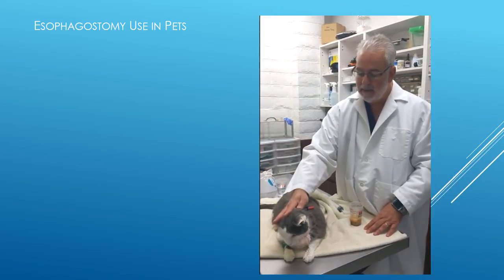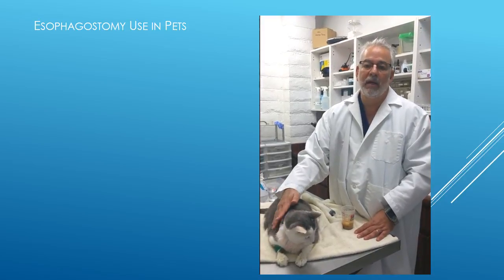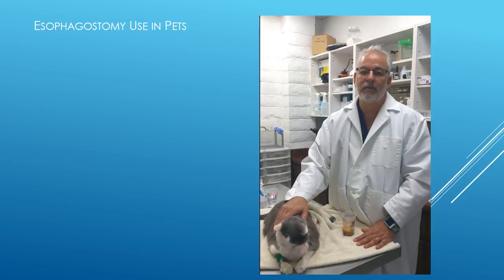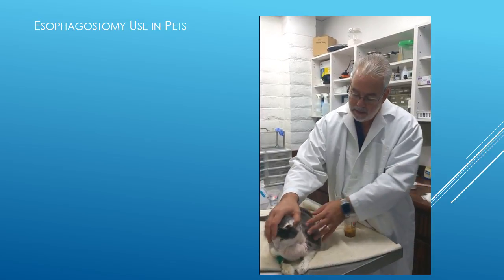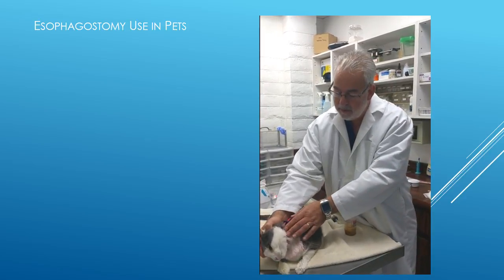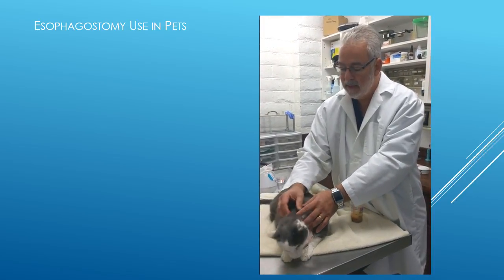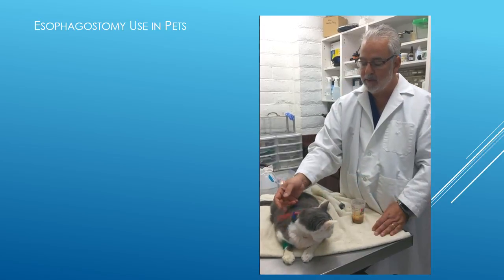This is Clyde. He's in the hospital today for liver problems, and part of his treatment is to get enough calories in him to help the liver heal itself. You can see on the side of his neck here where the tube introduces itself into the body, and then it's sewn to the side of the face and to the neck so that it just angles behind him.